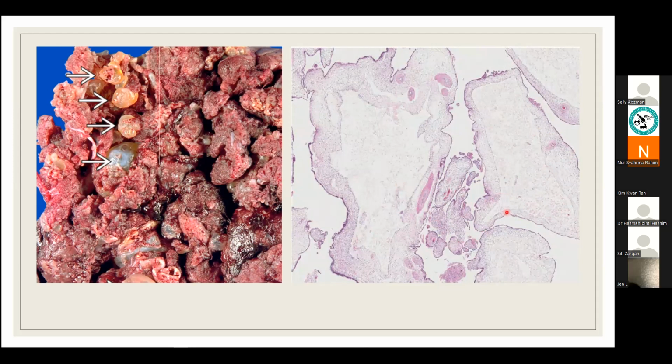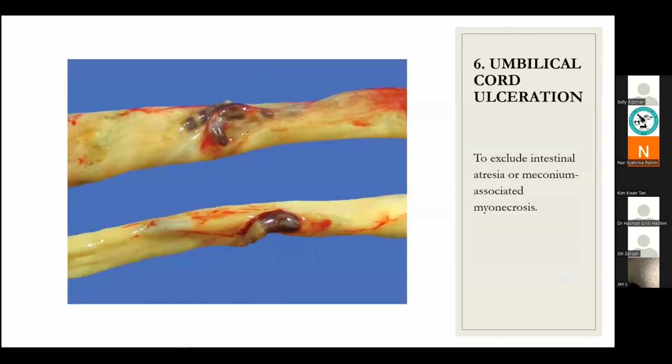But be aware, it is also always associated with thick-walled blood vessels. My first encounter with this case was with Sharina; she shared this case with us.